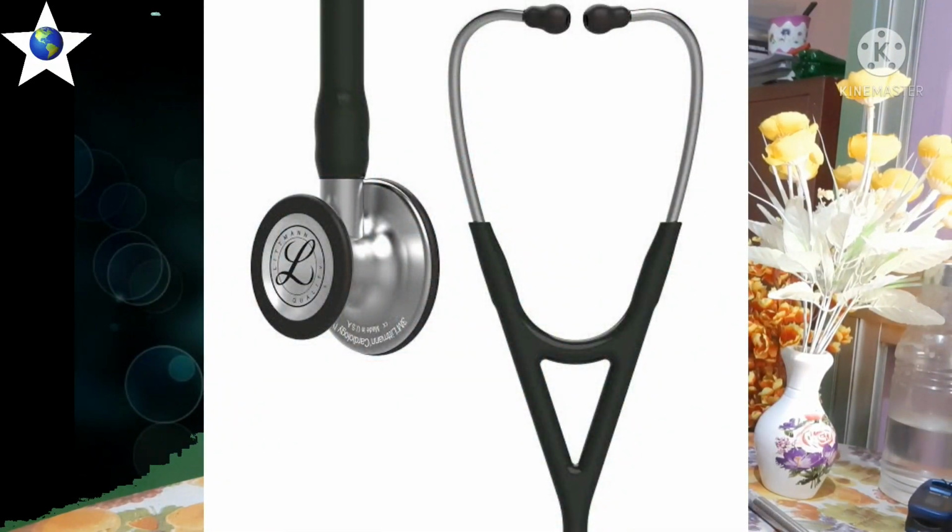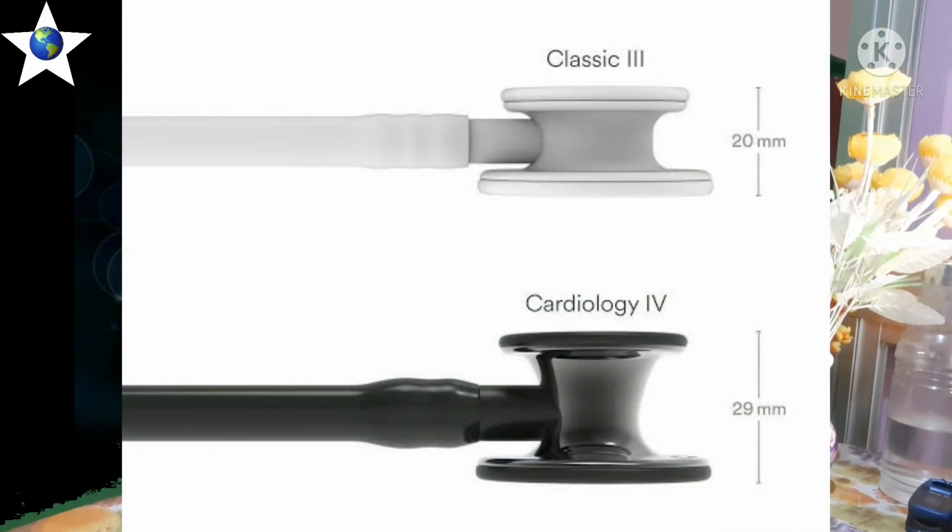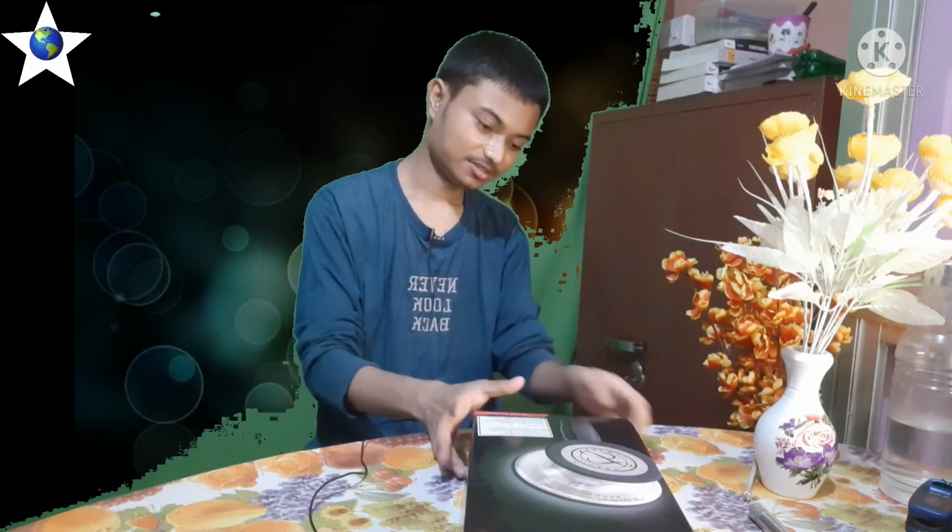This is also very good, and Classic 3 is the monitoring stethoscope. So Classic 3 is basically for monitoring, so you can check blood pressure and measure other parameters. And Cardiology 4 is diagnostic. If you want to auscultate, very detailed auscultation is important. This is important for detailed diagnosis, not the laboratory test, but the clinical examination. I am talking about clinical examination. If you want to hear heart sounds properly, then this Littmann Cardiology 4 will help you. It depends on whether you are a physician or not, but still I am showing my stethoscope.